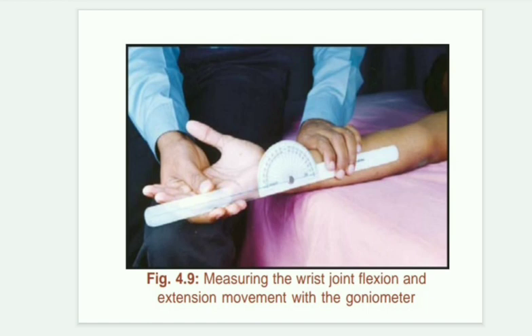about 0 to 80 degrees. The position is supine — supine is the best position to measure wrist flexion and extension. The fulcrum must be placed at the ulnar styloid process, the arm must be kept straight, and the palm must be facing upwards. The stationary arm must be parallel to the ulnar.